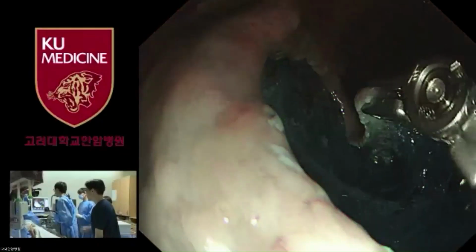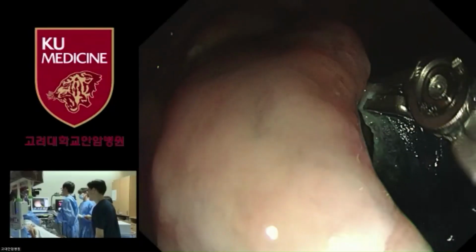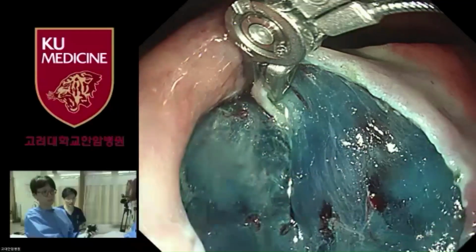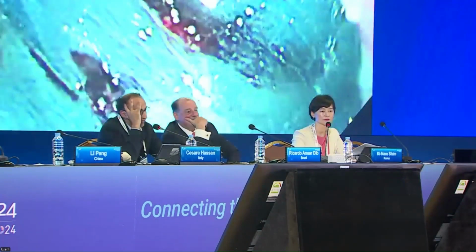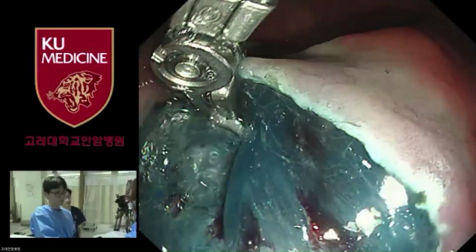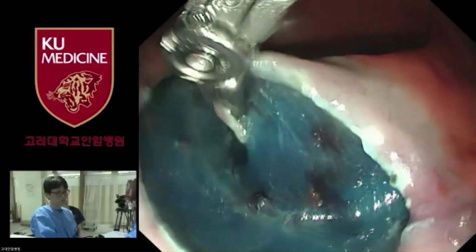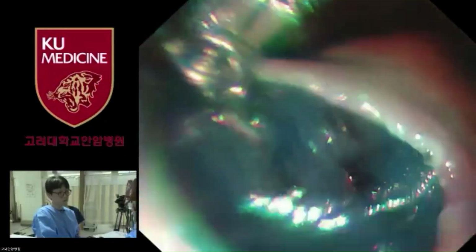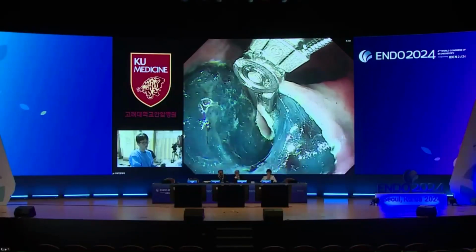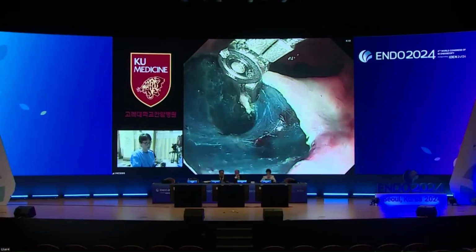And then we have one more working channel. Using the working channel, we can use the conventional endoscopic clip at the side of the approximation. So maybe we can show you the clinical trial video this afternoon when we are going to do the colon ESD case. I feel for the colon it is very important to close everything.